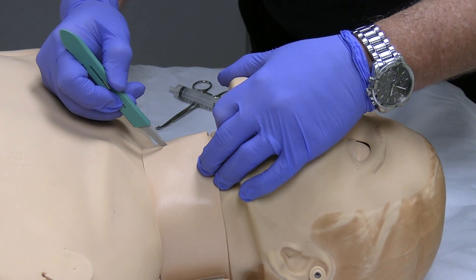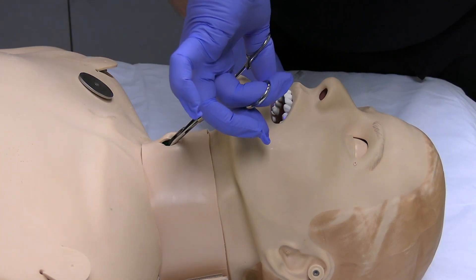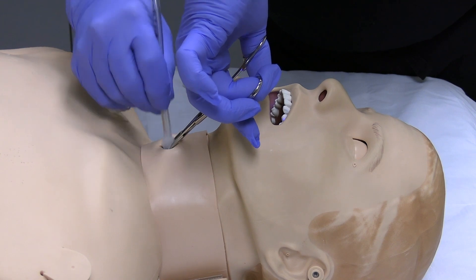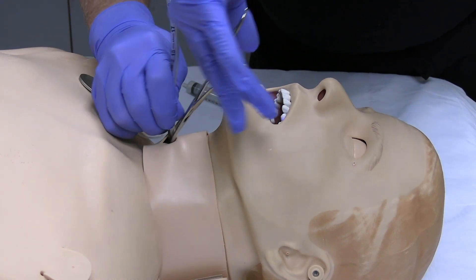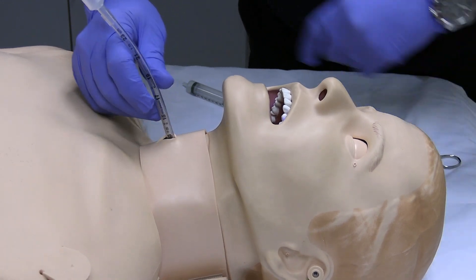You can perform a variety of procedures on this simulator for airway rescue. You can place oral airways and perform intubation with a variety of different devices including LMAs, i-gels, and ET tubes. You can also perform a cricothyroidotomy and access the trachea.